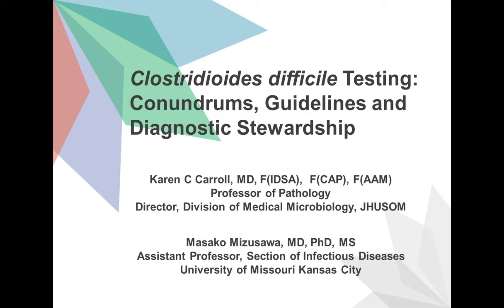We also have laboratory protocols in place to evaluate stool consistency, laxatives, repeat testing, and this is used for rejection. Physician must call lab to get approval to override cancellations. Dr. Carroll or Dr. Mizusawa, would you like to comment on this?